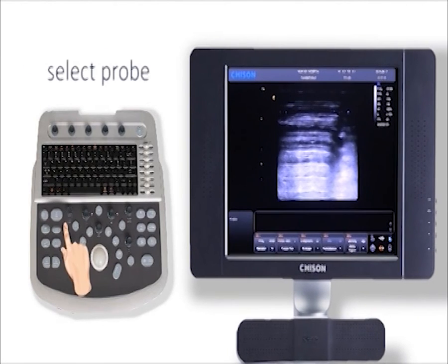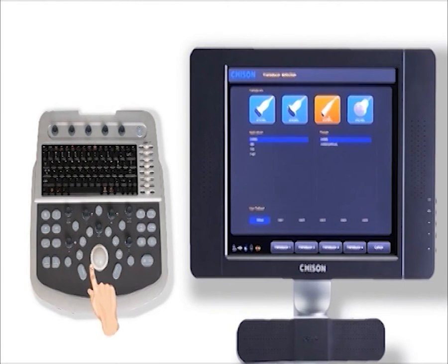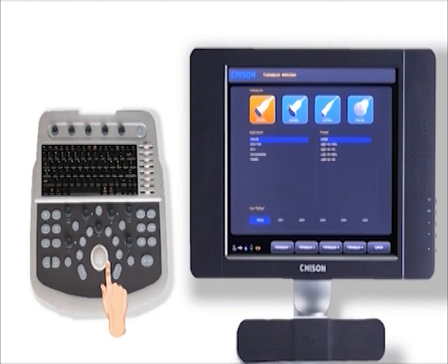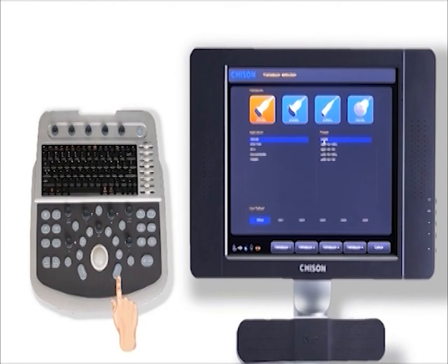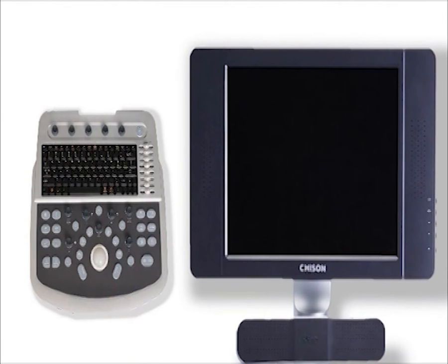Press the probe button to go back to the probe selection screen. Here are all the exams that are available. Roll the trackball to select the right probe, application and preset. Then double-press the enter button to confirm and go to the imaging screen.